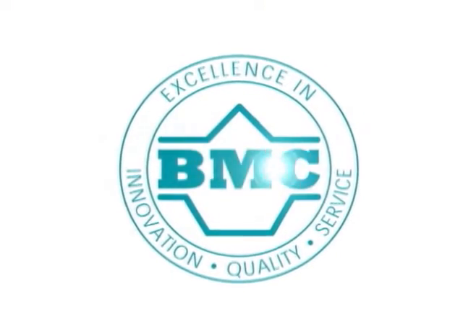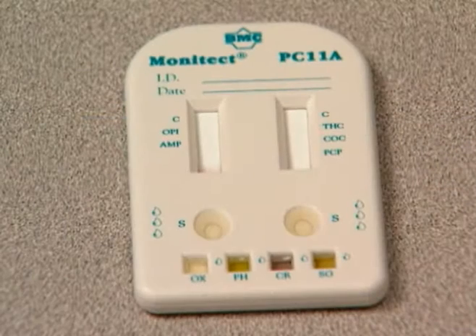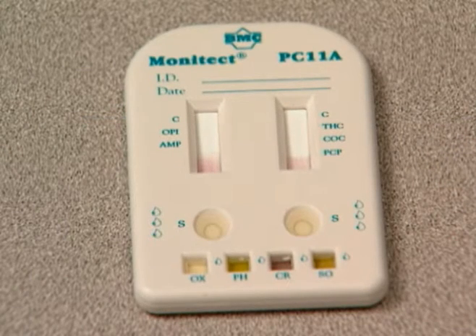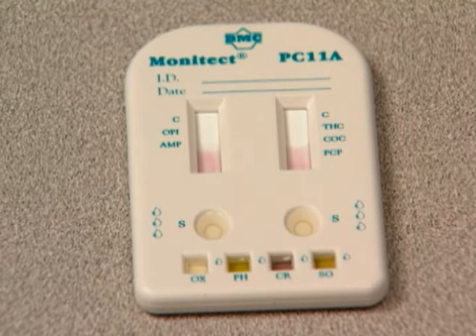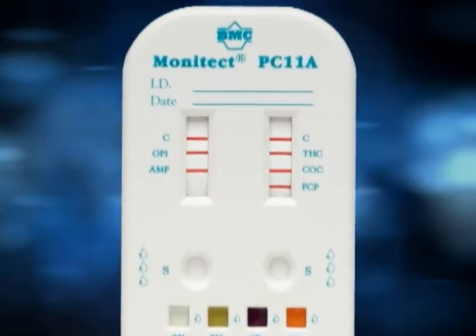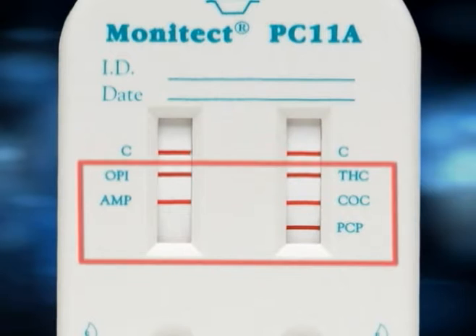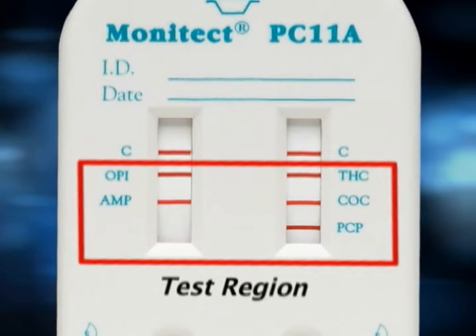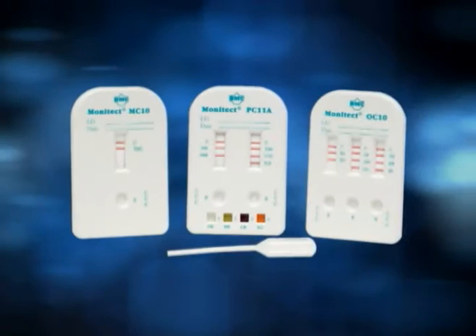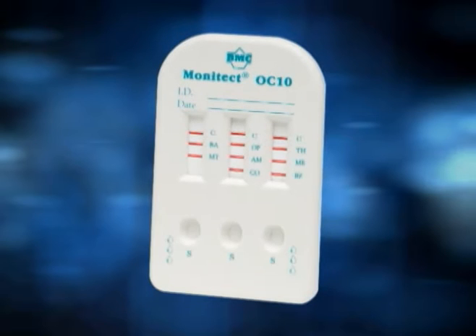Brandon Medical Corporation's Monitect drug screen cassette is a one-step lateral flow chromatographic immunoassay test for the rapid qualitative detection of various drugs of abuse and their metabolites in human urine. The Monitect cassette device contains membrane strips onto which drug conjugates are pre-coated at specific regions known as test regions. Monitect drug screen cassette is offered in various configurations in formats from 1 to 8 drugs.